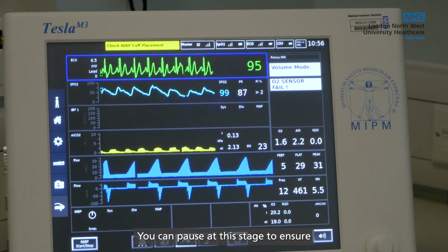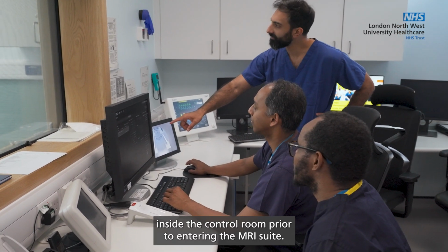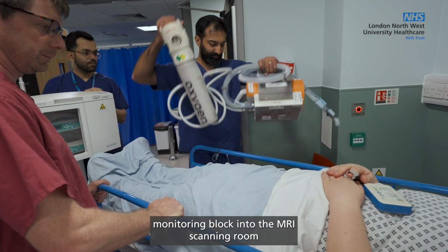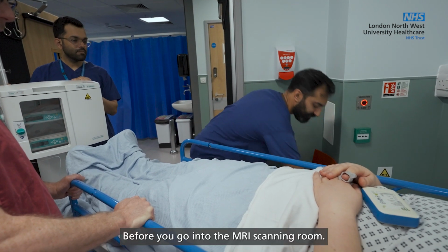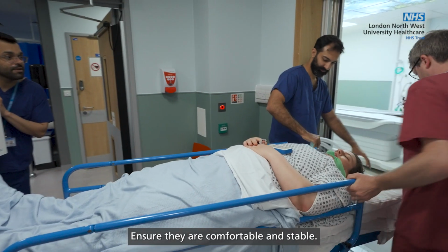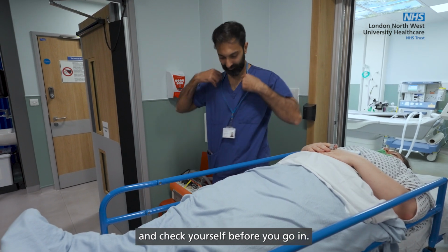You can pause at this stage to ensure you have a good capnography trace on your Tesla monitoring screen inside the control room prior to entering the MRI suite. Do not bring the portable monitoring block into the MRI scanning room. Before you go into the MRI scanning room, do a final sweep of your patient, ensure they are comfortable and stable, check their bed space for any equipment accidentally left behind, and check yourself before you go in.